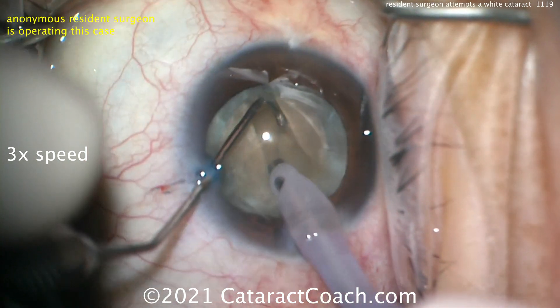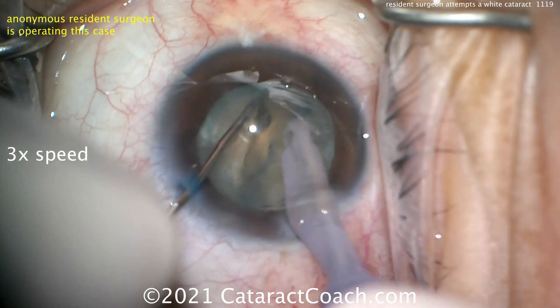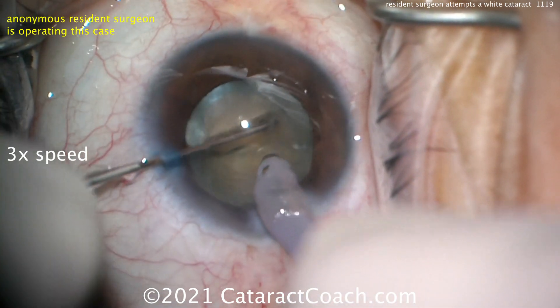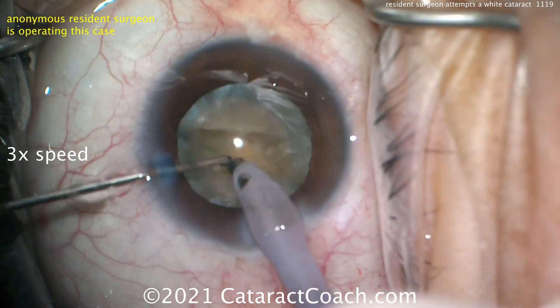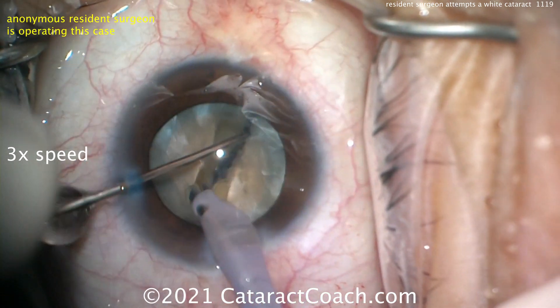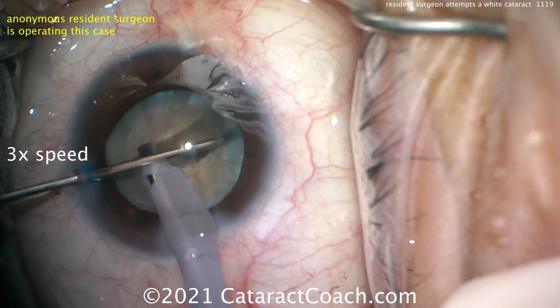A nice chop or crack — rotate that around and really get it separated. I like the extra effort here to really get it rotated and fully separated, because these can be fibrous as you're seeing here. The pupil came down because he inadvertently came off the foot pedal for just a moment, but really spend the time to make sure they're fully separated — it's going to be a lot easier.